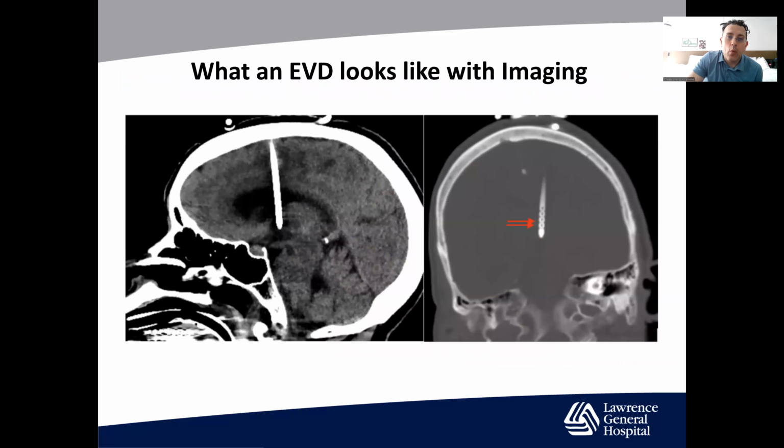And what about imaging? Well, if you look at imaging, you can see that there are multiple holes in the EVD. And this is the concept I wanted to show you in this particular image. So you can see these multiple holes if you get it at the right angle.